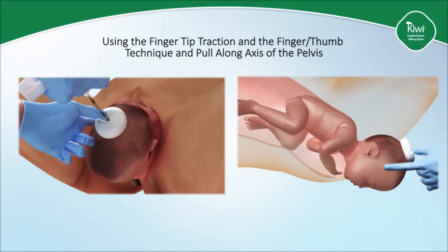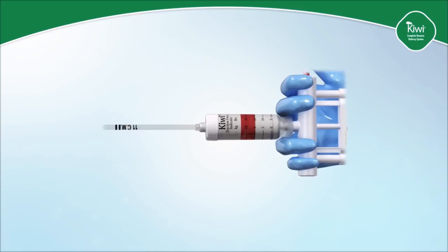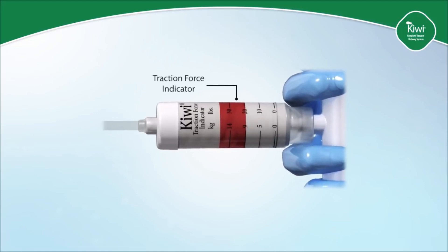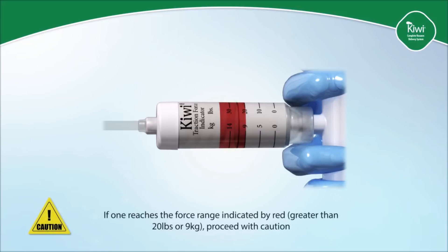Ensure to time your traction with the maternal pushing efforts. The Kiwi Omnicup contains a traction force indicator designed to measure the force exerted during traction, providing immediate visual feedback to the clinician as to how hard one is pulling — especially valuable for training and documentation purposes. During traction, gradually pull on the device to assist in the delivery of the fetus, but take care not to exceed the recommended force of 25 pounds or 12 kilograms. If one reaches the force range indicated by red — greater than 20 pounds or 9 kilograms — proceed with caution. However, if one is not making progress, then an alternative method of delivery should be considered.